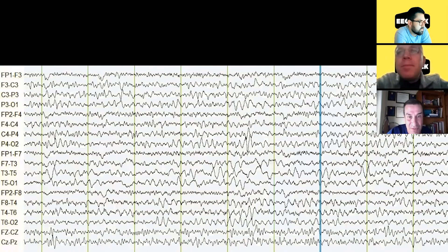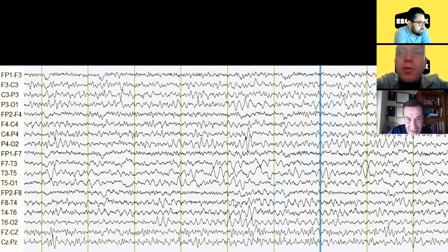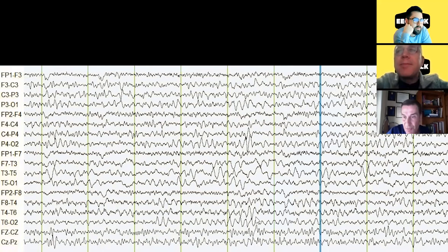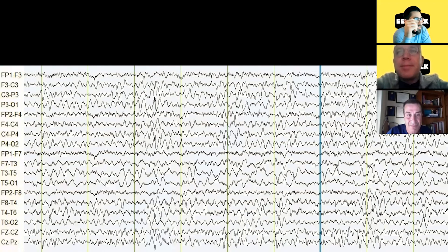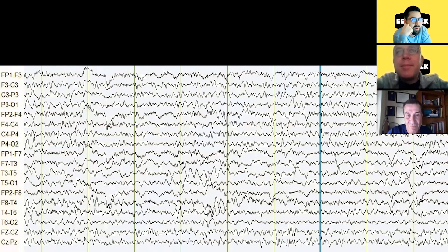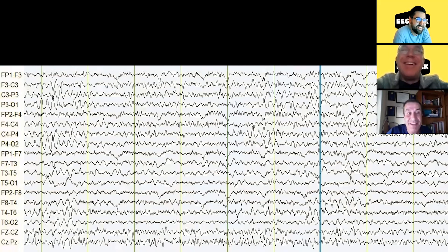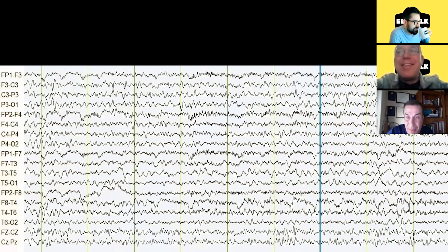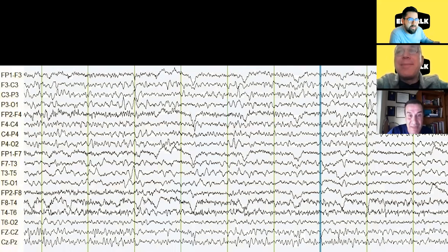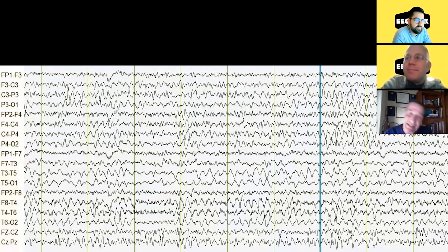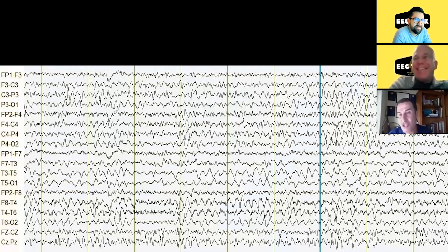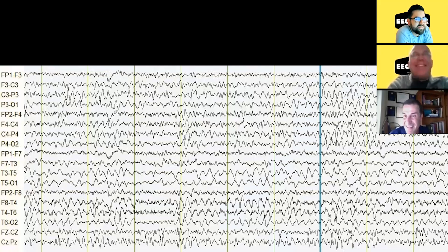It looks like they're probably becoming drowsy here. And then you have this — so people start panicking because yes, there are multiple phase reversals. This is all benign. You know what I've noticed too — if you change the sensitivity at some point it's probably going to phase reverse. Yes, absolutely right — we can make a lot of things look like a phase reversal. It's only a matter of where the maximum is. If it takes three minutes to discuss if it's a sharp wave, let's not make it a sharp wave.